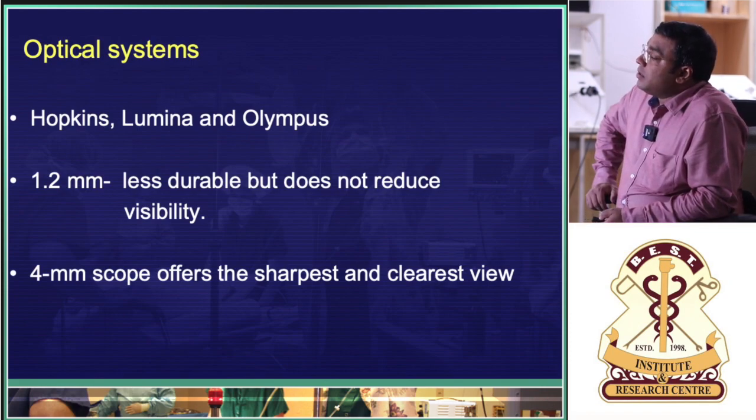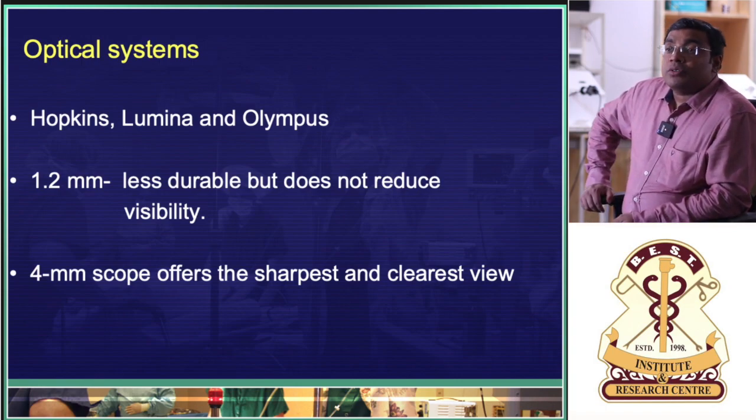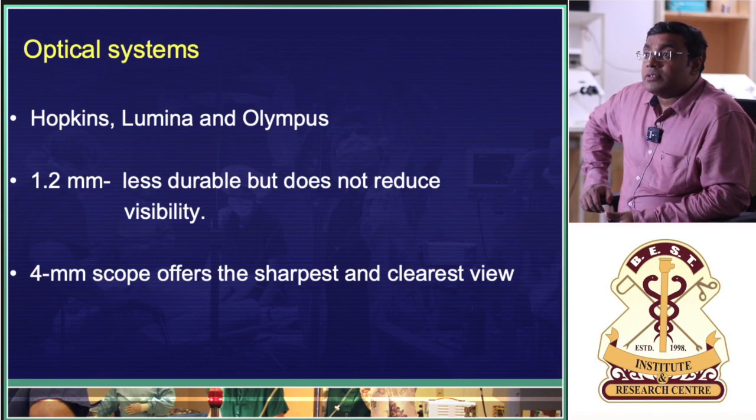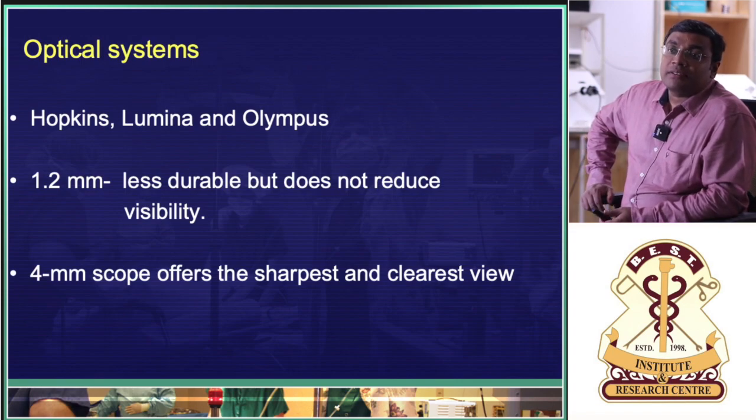There is something called a 1.2 mm telescope. So the telescope is just 1.2 millimeter thick. What is the name of that telescope? You will read and tell me.